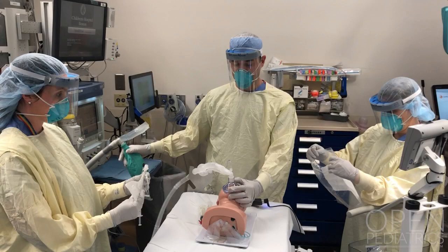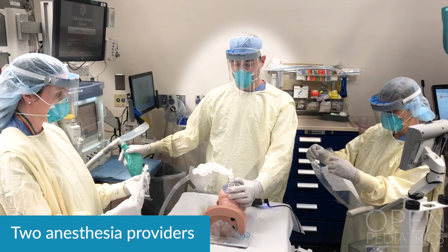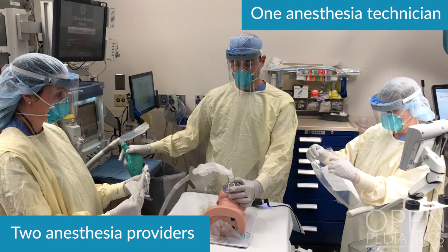When managing the airway and planning to intubate a suspected or confirmed COVID patient, you need two anesthesia providers and one anesthesia tech. The patient should be pre-oxygenated with as low a fresh gas flow as is considered safe, avoiding any positive pressure mask ventilation throughout the induction to avoid aerosolizing the virus. A very clear plan of action between all anesthesia providers is essential.